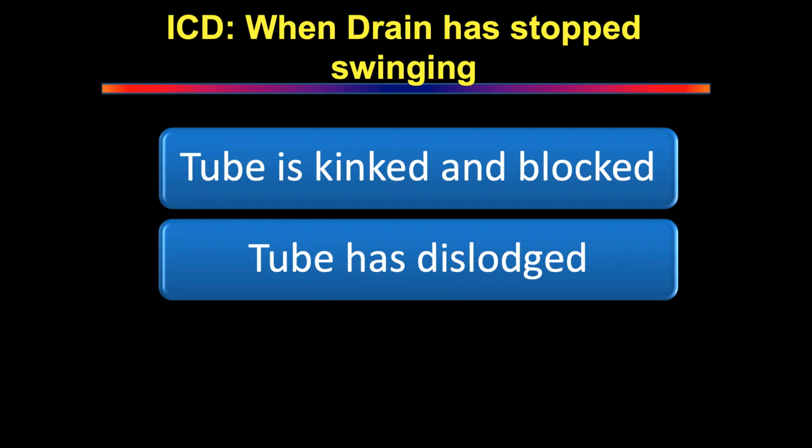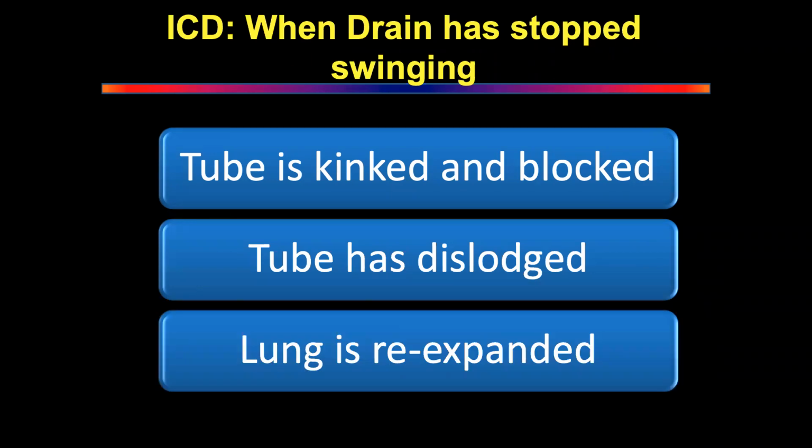All right. Tube has come out and the swinging is lost because you are not intrapleural. And then the last one you said, lung is expanded. Okay? Is this clear? Happy with this? Yes, sir. Right.